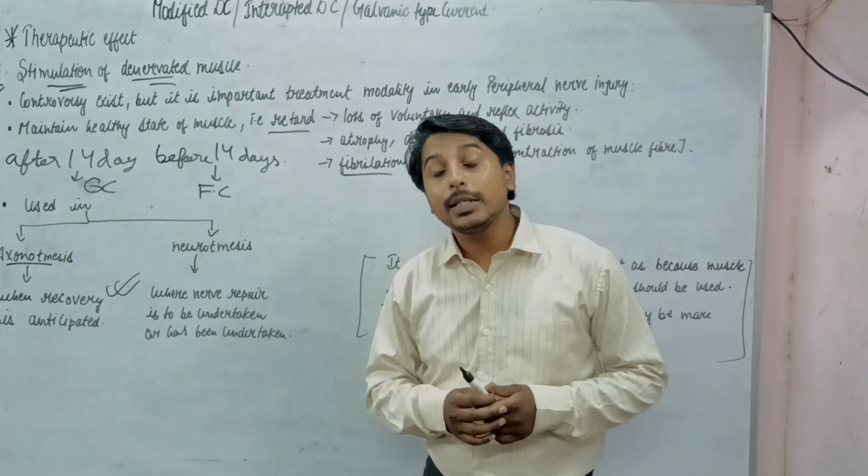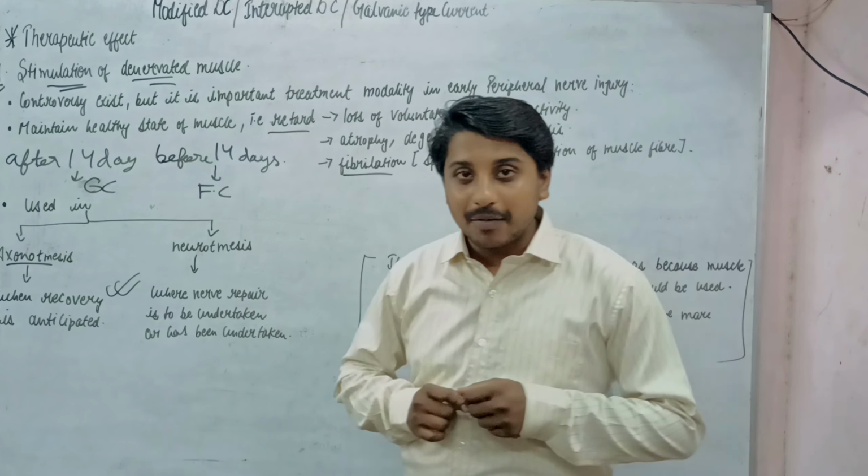Now we will study the technique of application of galvanic current.